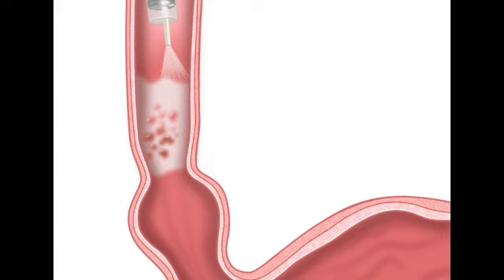So in the stomach, it's really about drawing borders. Yes, drawing a map. It's taking a murky transition zone and giving it a highly visible boundary line so the doctor knows exactly how far the abnormal tissue has spread. Exactly. And that concept of drawing borders becomes even more critical when we move down into the colon. Okay, what happens in the colon?